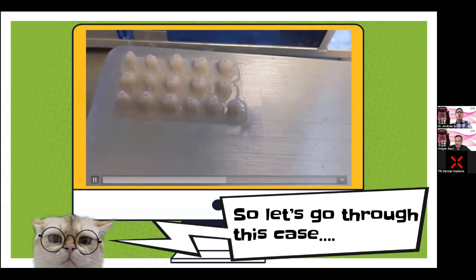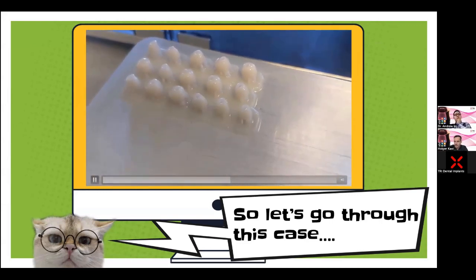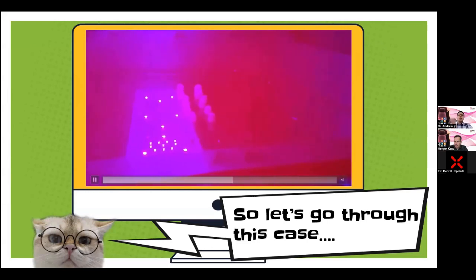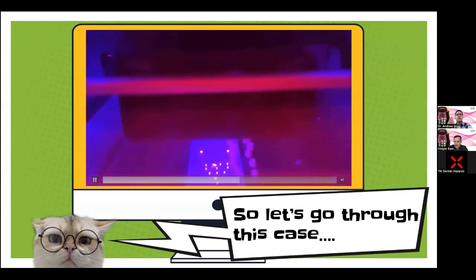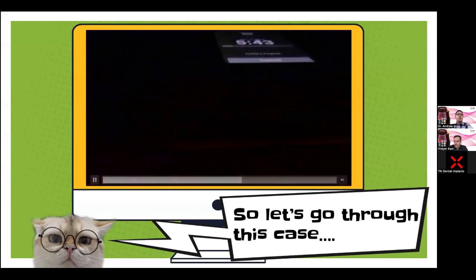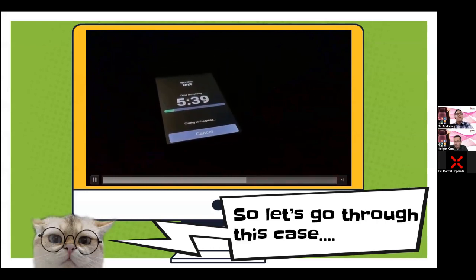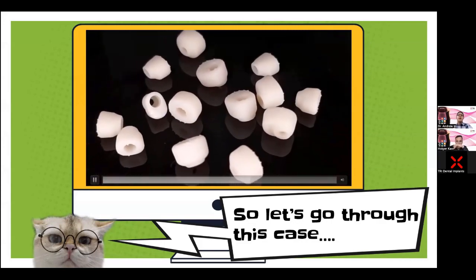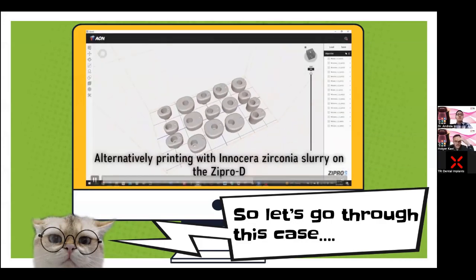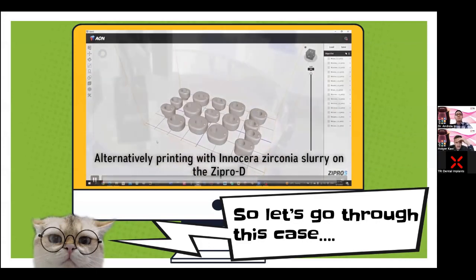So these are printed in Onyx, and then I actually print these in zirconia as well. As I said, I don't tend to print healing collars in zirconia that much these days, unless it's a slam dunk case, because it's very hard to adjust chairside, if not impossible. Implant surgery can be a stressful procedure already, and then you add on adjusting zirconia, and we all know how difficult it is to drill zirconia.